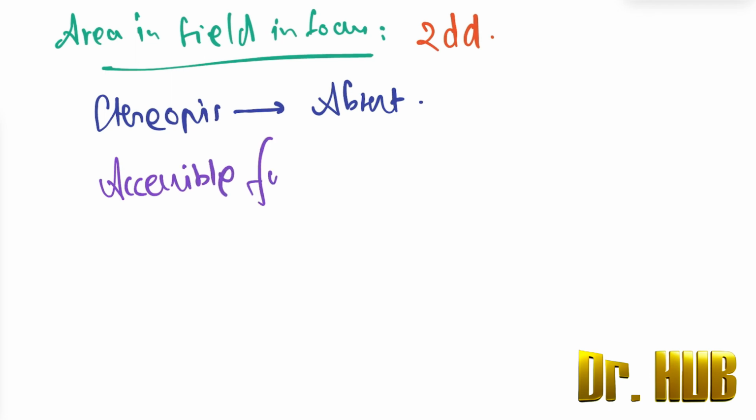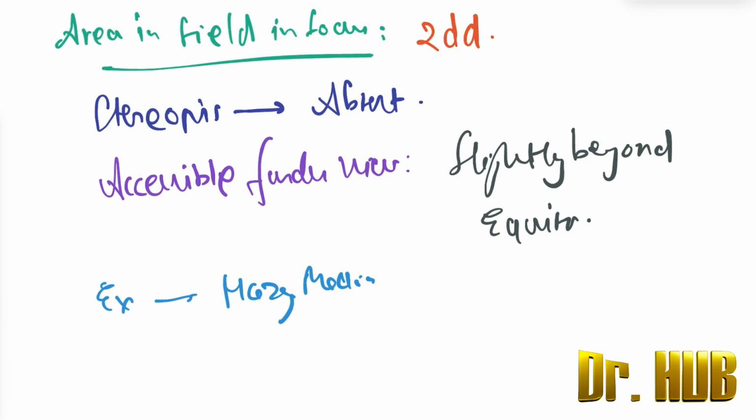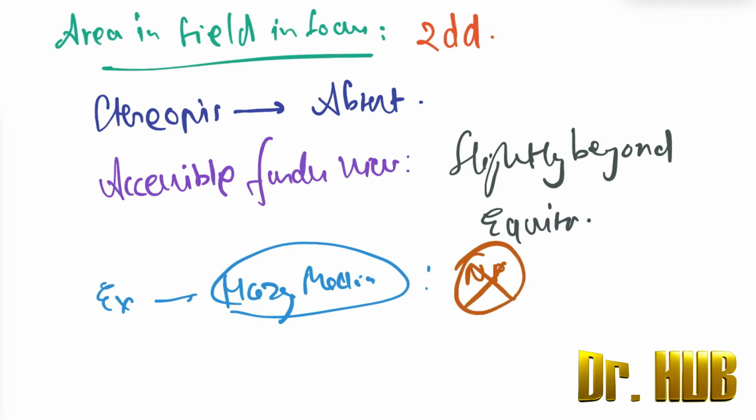Then looking at the accessible fundus view, here it is slightly beyond the equator. Then comes the examination through a hazy media. It is not possible.